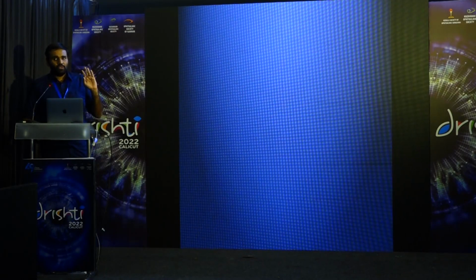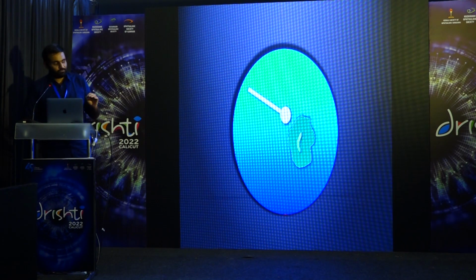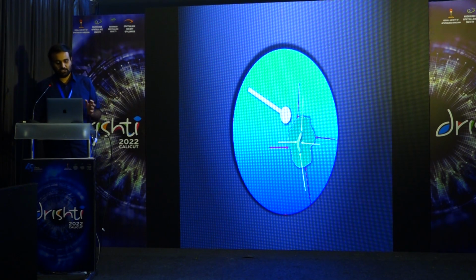Now the only thing that I'd like to touch upon when we talk about RCE management with the diamond burr is that most of us make the mistake of going and polishing the edge of the defect. That is not where the actual polishing needs to be done. It actually has to be done here.